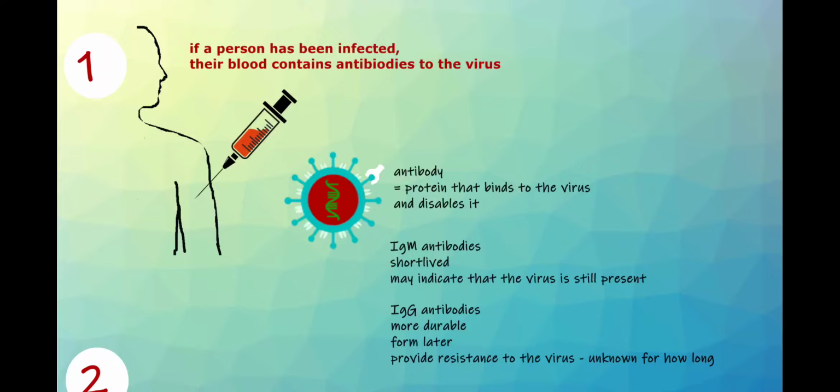Against COVID-19, our immune system produces antibodies, and we study whether those antibodies are present in your blood or not. If they are present, yes, you have an infection, because your body is producing antibodies against that virus. If they are absent, then you are fine and have not been affected by coronavirus yet. That is how we conclude it.